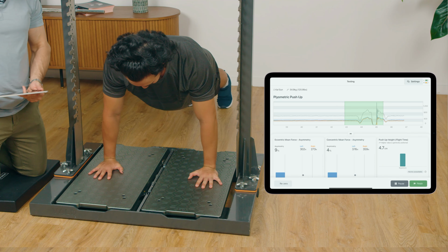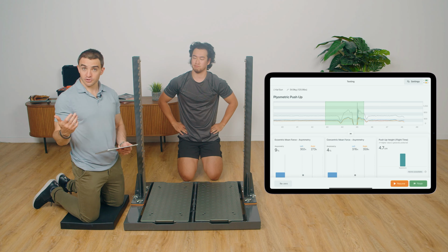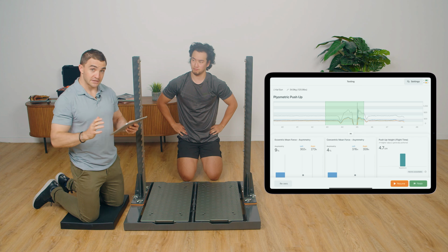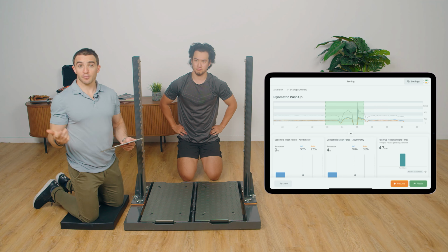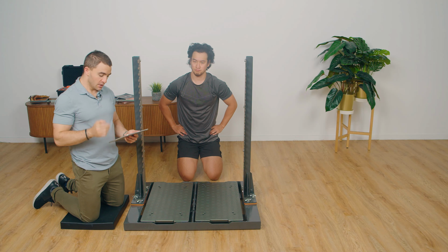Good, and relax. We'll just do 1 rep for the purposes of today. And what I'm looking at here, similar to my push-up, I look at the eccentric and concentric mean force asymmetries. So as he's loading in the eccentric phase, as he's expressing force in the concentric phase, I want to see which one is doing more work. And then the output, which is the height of that push-up jump or plyo push-up, I want to measure that as well.